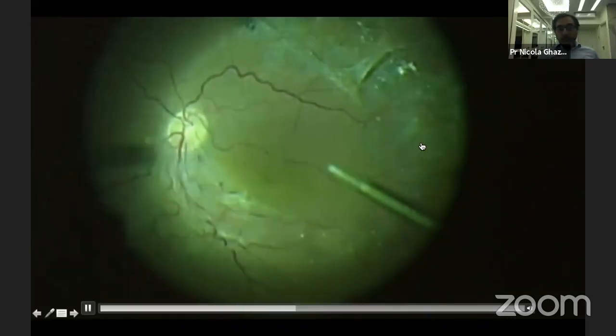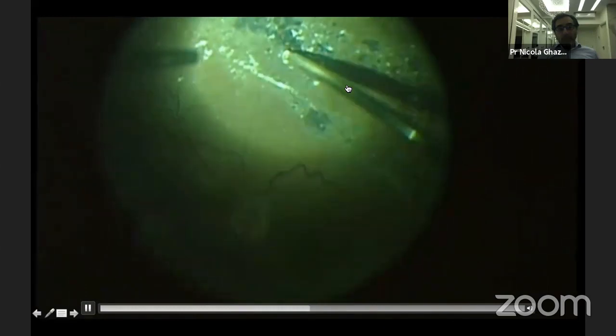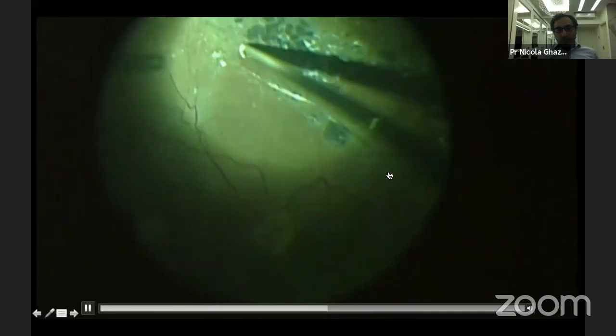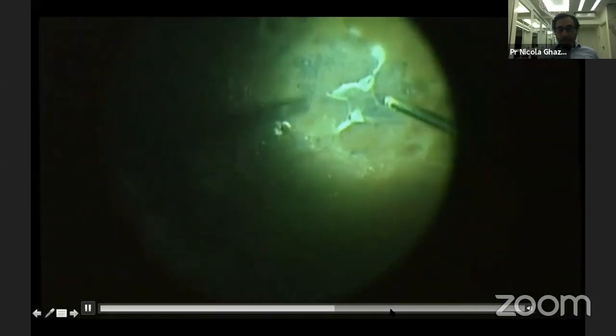And then after that, look how the vessels retract when we remove the inner retinal leaflet because of traction. So when the inner leaflet is that degenerated, I would advise complete excision of the inner retinal leaflet. And once this is done, then the rest of the surgery is straightforward. It's just flattening of the outer leaflet with air fluid exchange, and then performing endolaser.